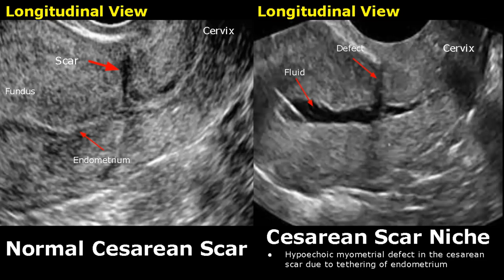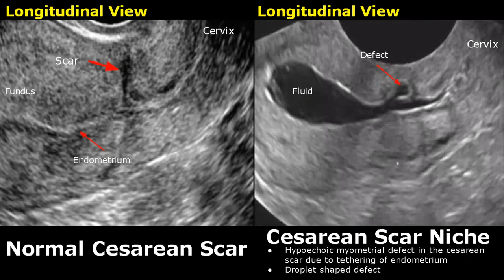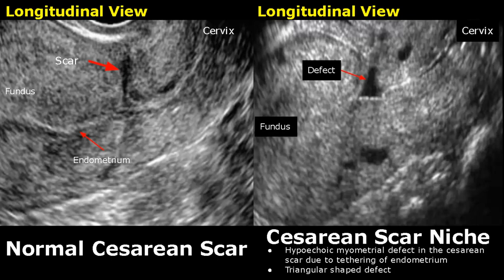In this image, there is a large accumulation of endometrial fluid. This defect has a teardrop shape. Triangular shaped defects are common as well. We can see a proper triangular shaped defect here.